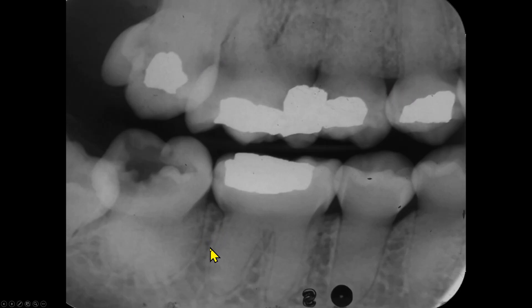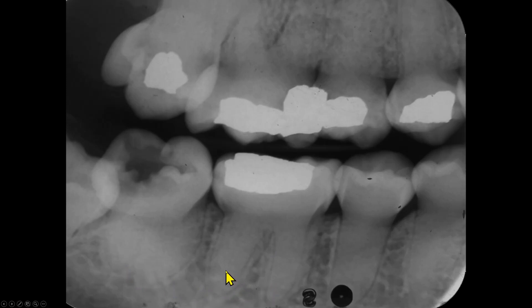The laminar dura that we see here is intact. The apical periodontal spaces of these teeth are also within normal limits. And there is probably a carious lesion on the crown of this second molar.